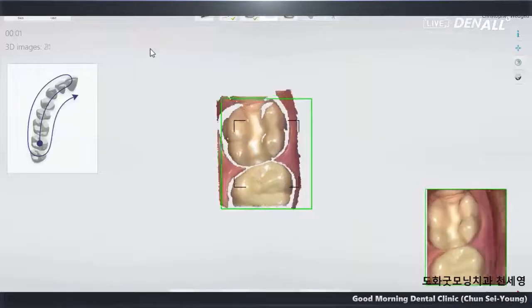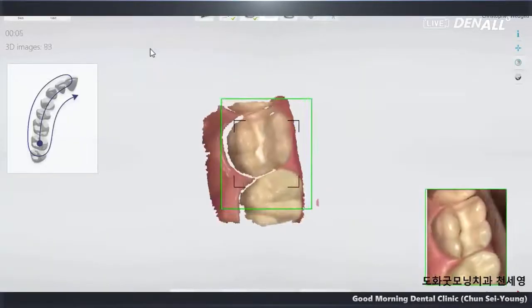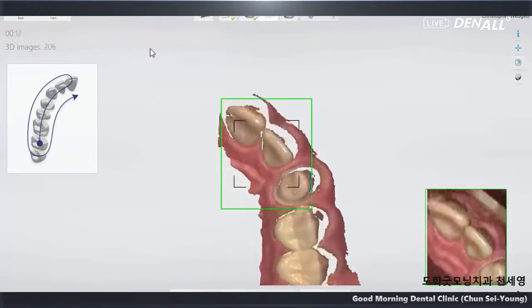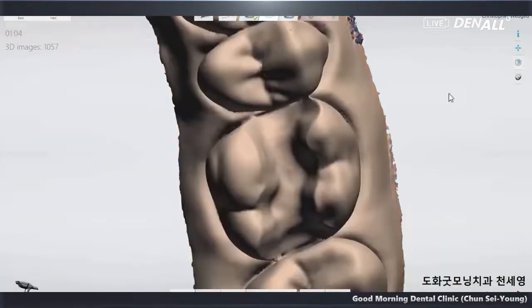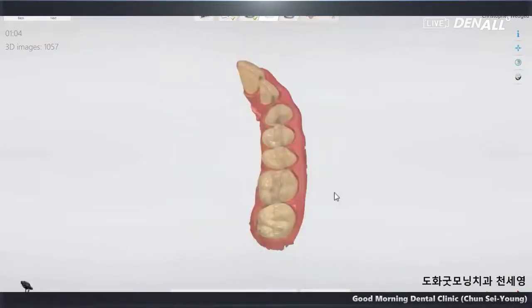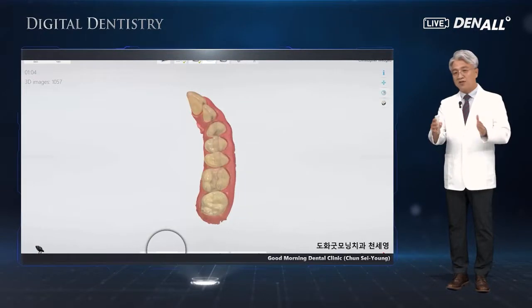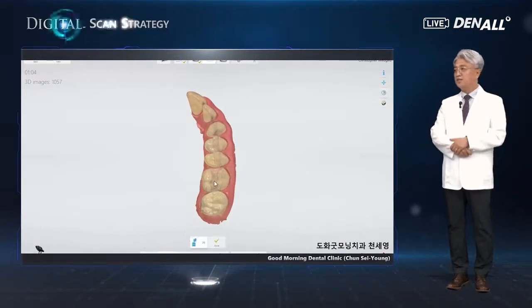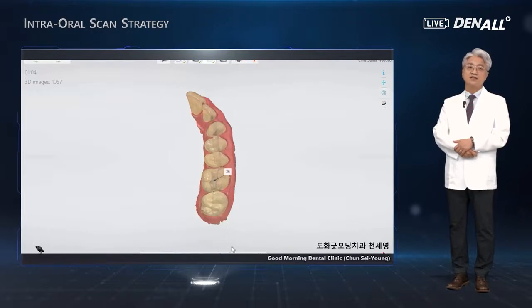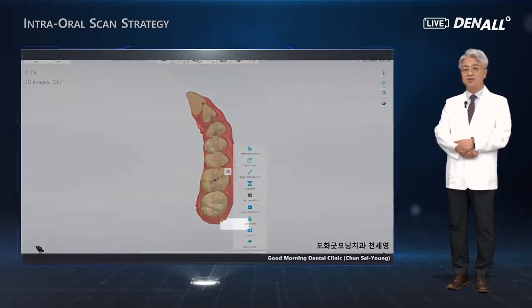Let's look at Inlay and Onlay. In this case, this is much more convenient or simple than crown. Clinically, using oral scanner, I believe this has been the best item that has been improved. When it comes to impression taking, Inlay Onlay has improved quite a lot using the scanner.